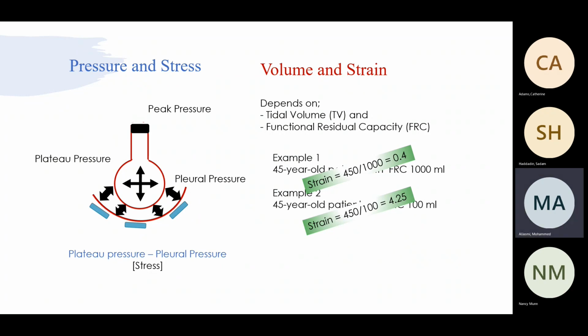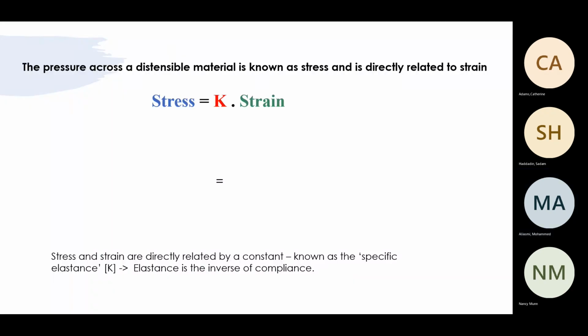But how can we put these together, the stress and the strain? And please, Dr. Megri, I would like to apply this on a patient. Yes, that might help me for my board, but I need to know how that helps me in real life. All right, so stress equals constant times strain. Do I need to memorize that? No, I need you to memorize the concept to understand both are related.